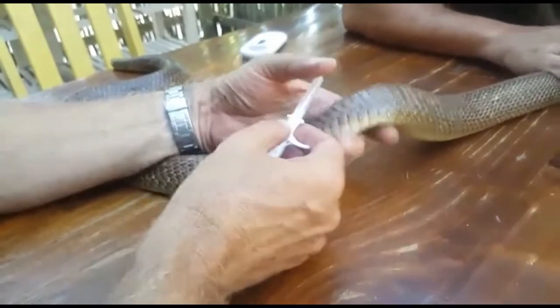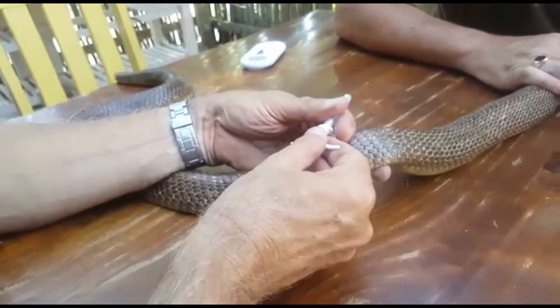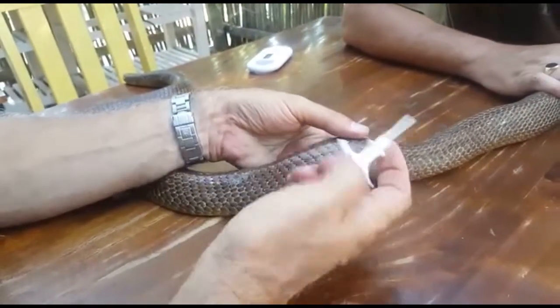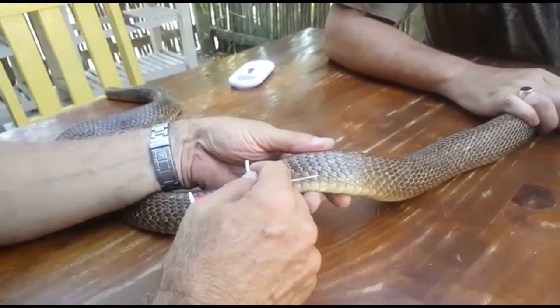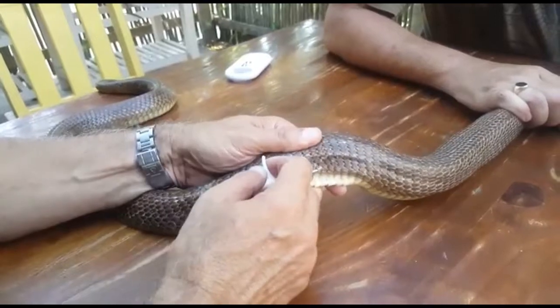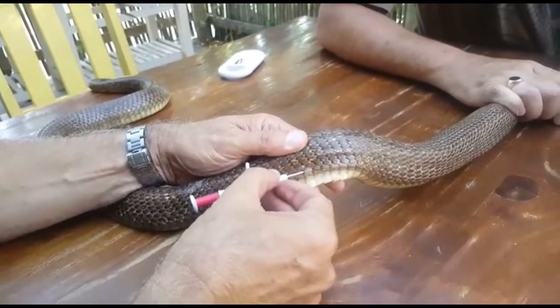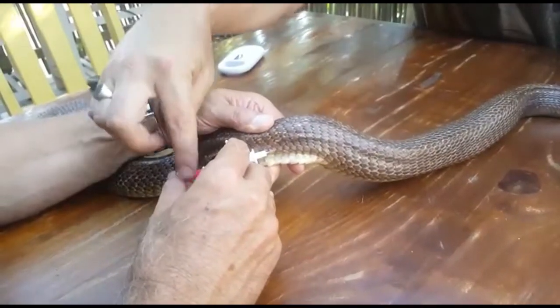Right, so what we're doing here is we're going to chip this snake and we're going to go in just under the skin on the right hand side, roughly mid-body. So you got a good grip there Fadi? Perfect. Okay, so I'm going on the side, okay, just under the skin, all the way in. Okay, now we're going to release the chip over here.